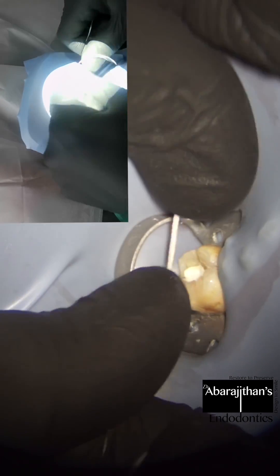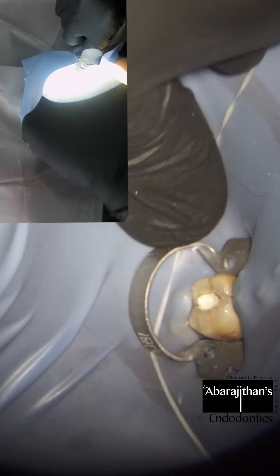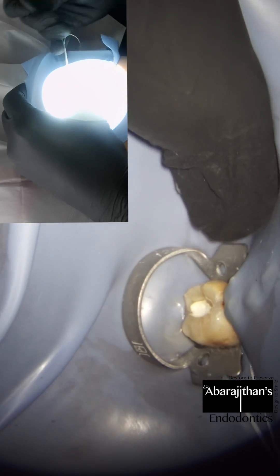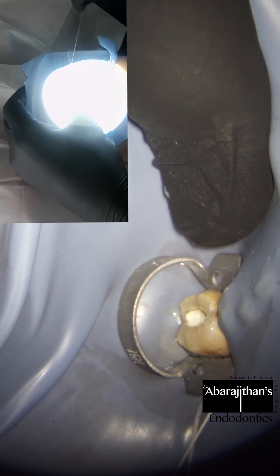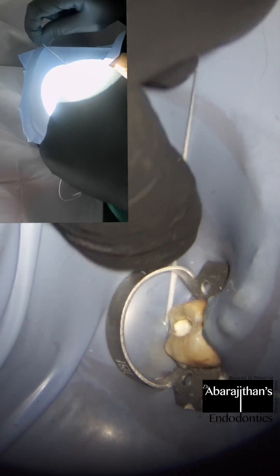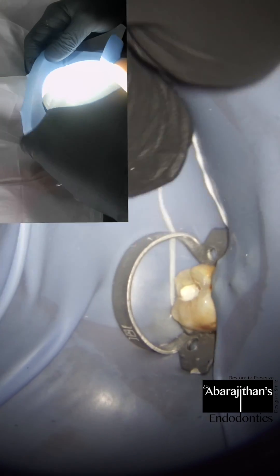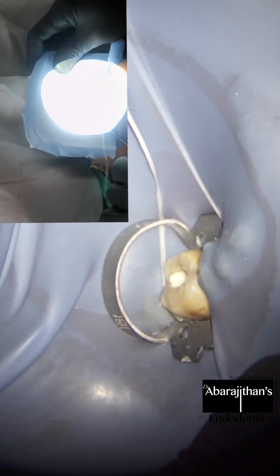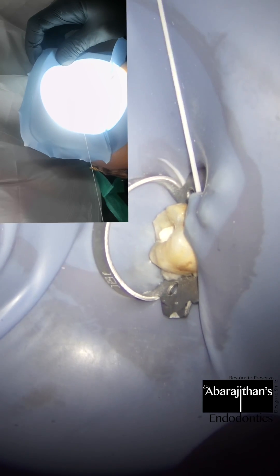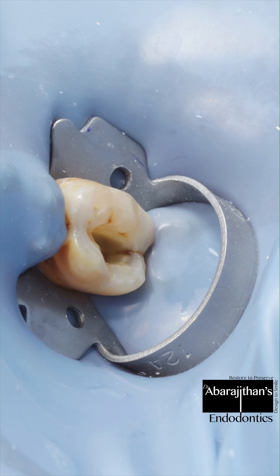Most people stop at this point, but after this comes the most important step — that is flossing the tooth around all four corners: the mesial, distal, buccal, and lingual. Interproximally, we pass the floss around like this, and then we pass the floss from the buccal side and pull the loose ends towards the lingual side to have better adaptation of the sheet underneath the clamp on the buccal side. The same is also repeated from the lingual towards the buccal side.